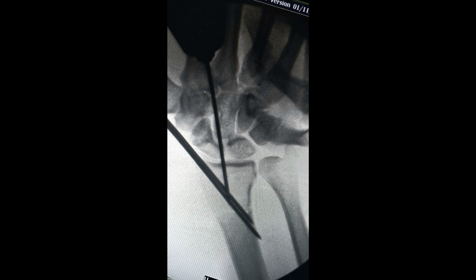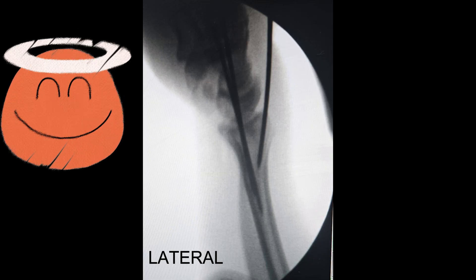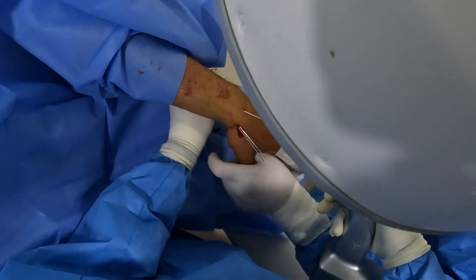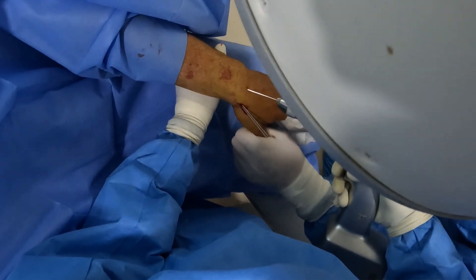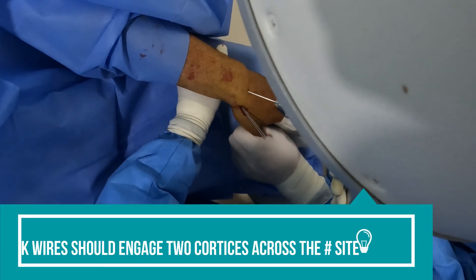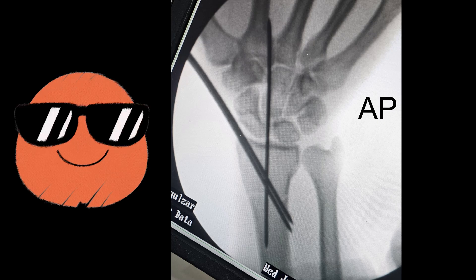The trajectory looks fine in the AP view. I'll also take a lateral view to confirm the trajectory — it looks okay, so I'll accept this trajectory and move ahead, progressing the wire. It is a rule of thumb that once you place K-wires, each K-wire should engage two cortices across the fracture site — that is the most important step.